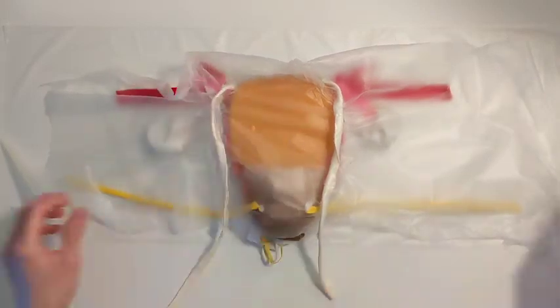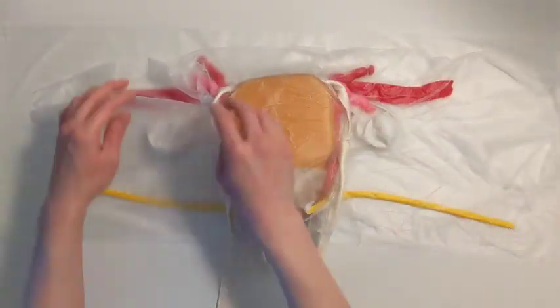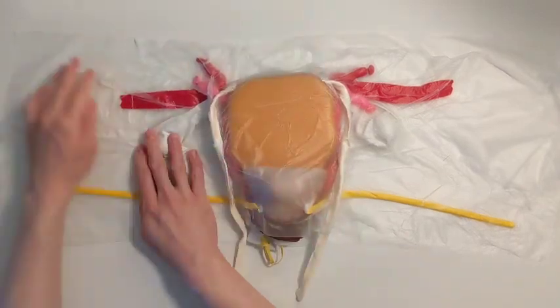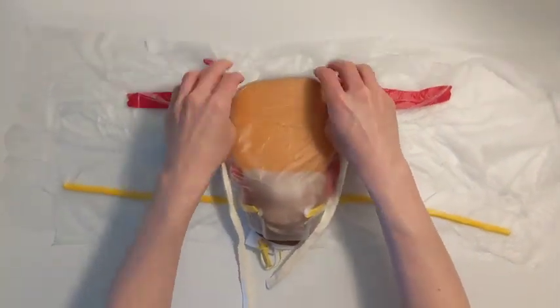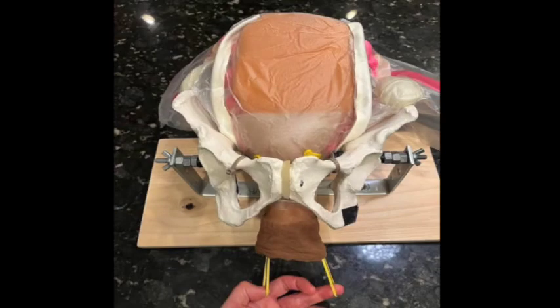After doing this, carefully press down on the rest of the press-and-seal, both layers against each other. Ensure wrapping the press-and-seal all the way around the fallopian tubes, ovaries, ureters, and edges of the uterus and vagina. This low-fidelity model with anatomical landmarks has been well received at our residency programs for simulation of cesarean hysterectomy.